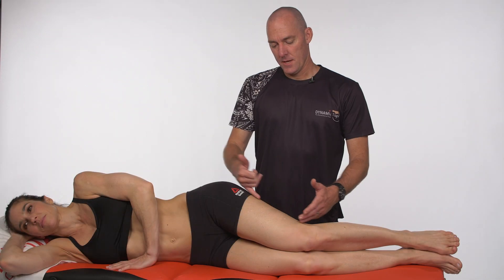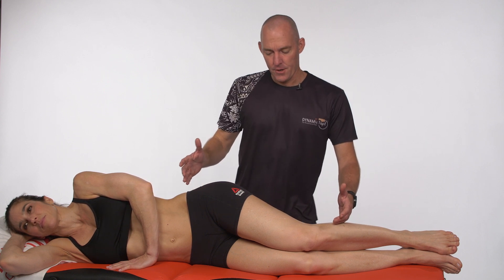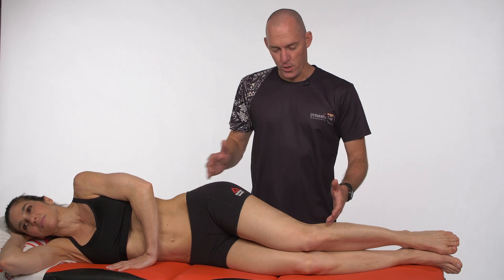This technique is for the iliotibial band, so essentially we're trying to do some of the work that the IT band would have to do in controlling that lateral pelvic motion. It's quite a hard one to get good purchase on the lever.